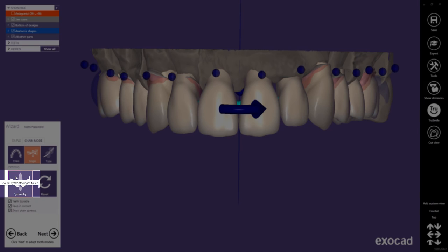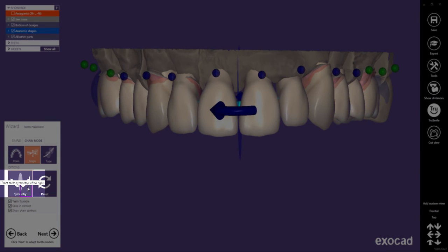The upper left button creates an overall symmetry from the patient's right side to the left side. The upper right button creates an overall symmetry from left to right. The lower right button creates a front teeth symmetry from left to right. The lower left button creates a front teeth symmetry from right to left.